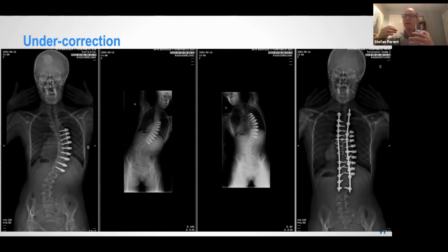And the nice thing is that when you go back inside, you can see that the facets, it's like a virgin spine, right? It's just the facets are right there. There's no fusion. The section is the same. So it's not having a growing rod system that you have to work around, remove everything, do the osteotomies and all that stuff. You can do your procedure as you would, except maybe for putting the screws.